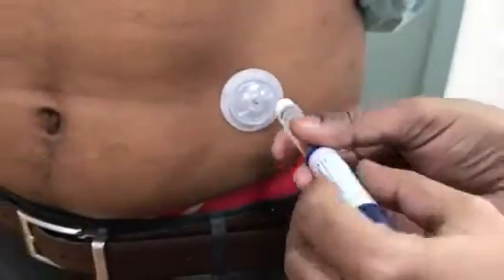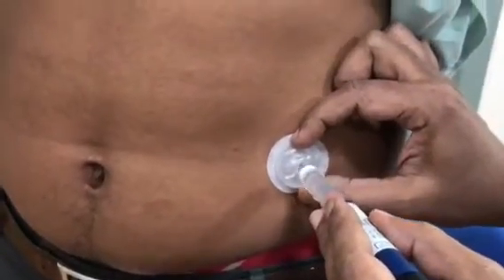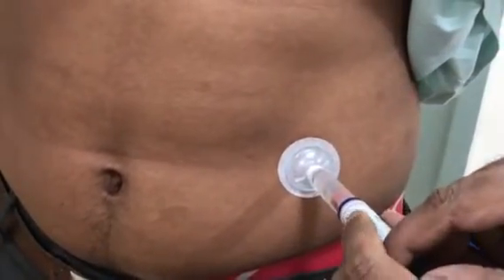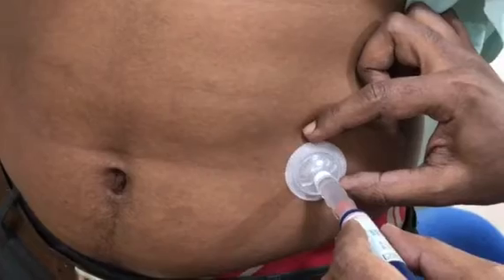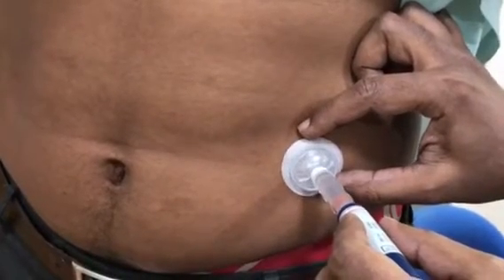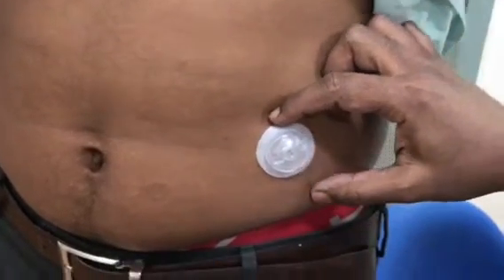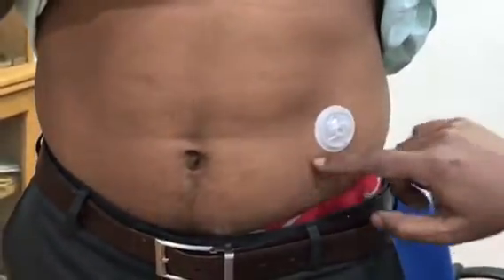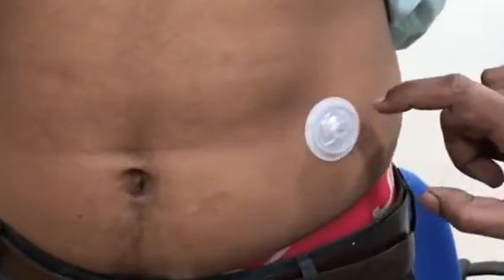This is a regular injection — I will give two units as part of this demonstration. This is the central area where I have injected. I'll wait for 10 seconds and then pull out the needle. So simple! You can have even up to 75 injections over three days.